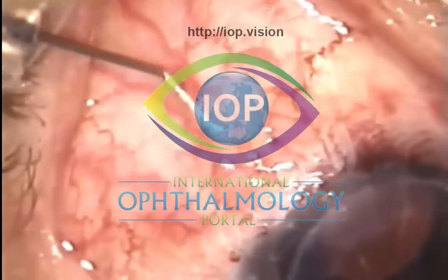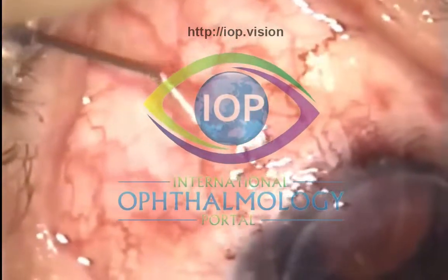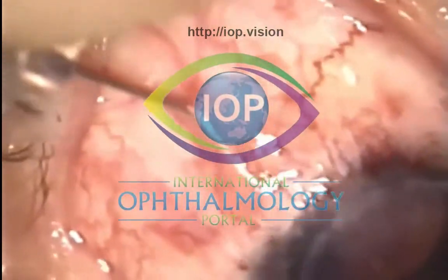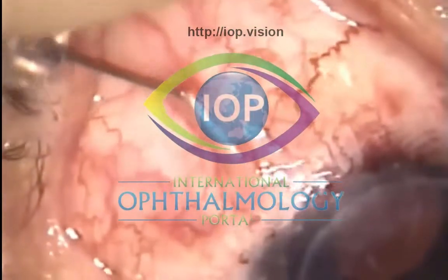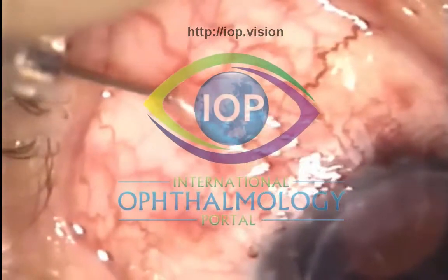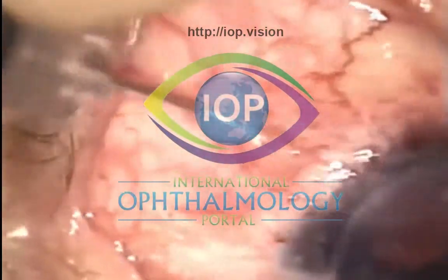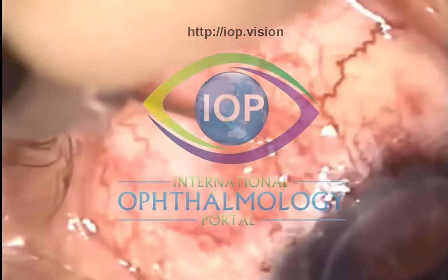I'm really struggling to advance the needle tip, making sure there's no lateral movement. Now I'm being very aggressive. I know exactly where the tip is, and that's why I can afford to be aggressive — I'm sieving this tissue. As I'm sieving this thick scar tissue, I'm noticing that I'm just not getting anywhere. So I'm now doing a subscleral flap needling. You can see I'm going through.